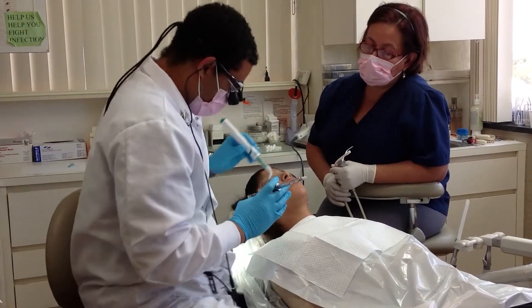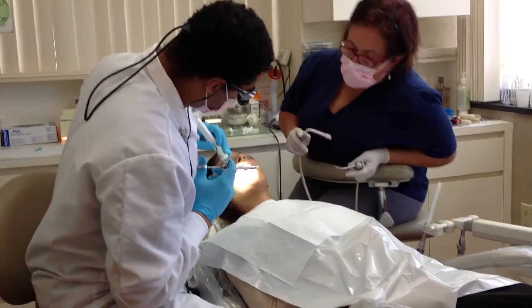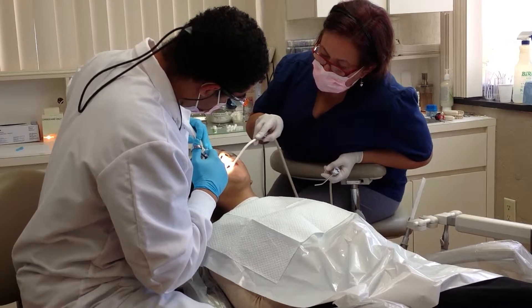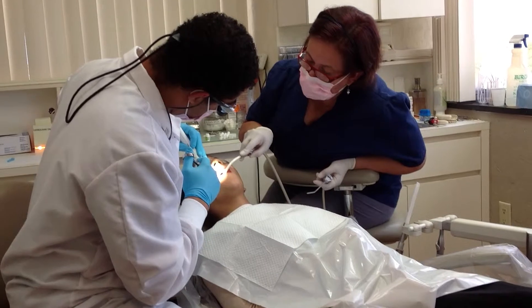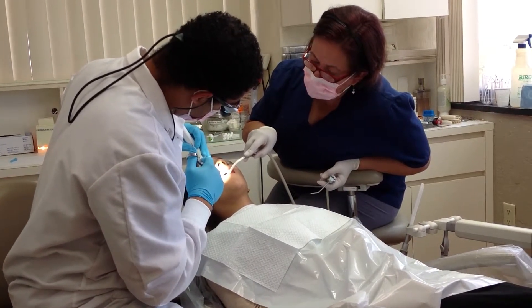And we got this guy. It's not that much at all. You're doing great. You doing okay? Uh-huh.